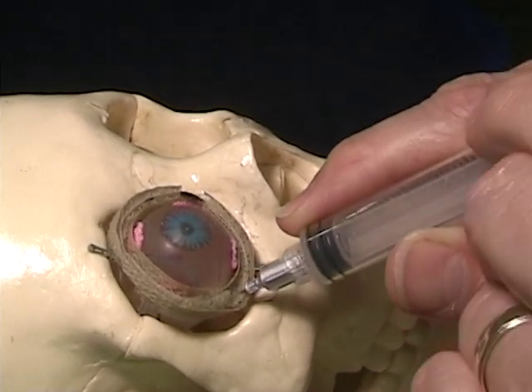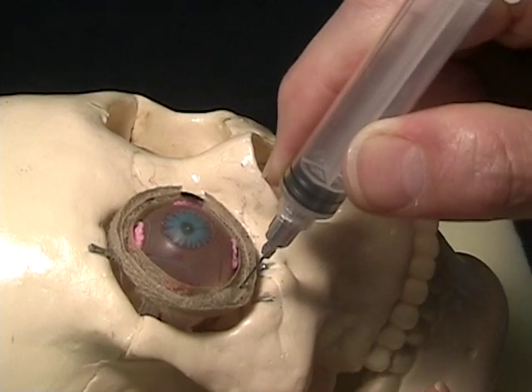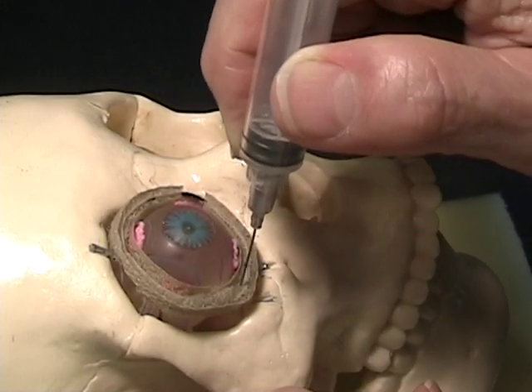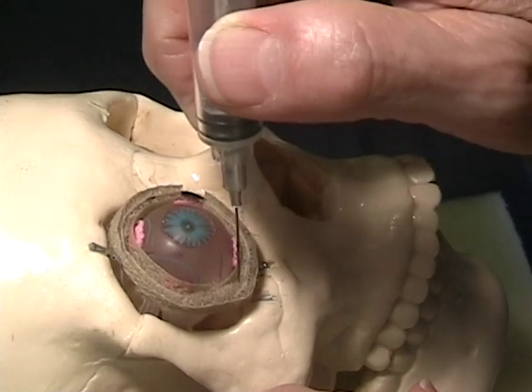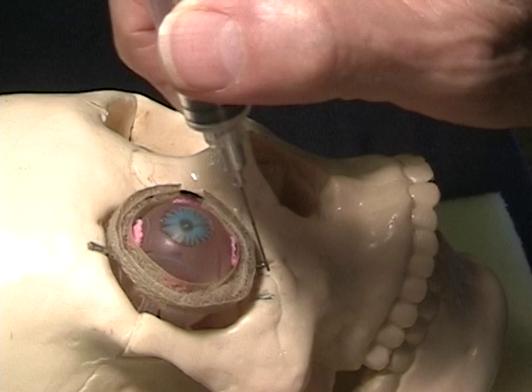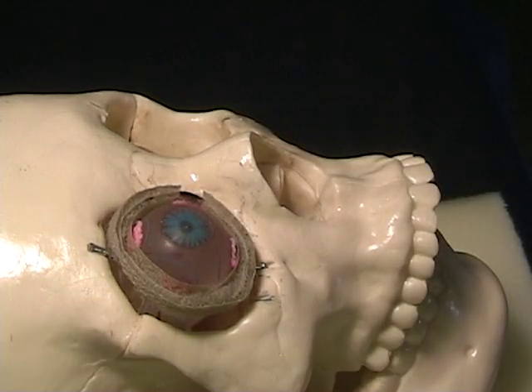Once the anesthetic is injected, we can start to withdraw the needle, coming back to about 90 degrees. At 90 degrees, we begin to bend the needle tip towards the orbital floor so that as we withdraw the needle, it's at approximately the 120-degree angle that we originally used to insert it.